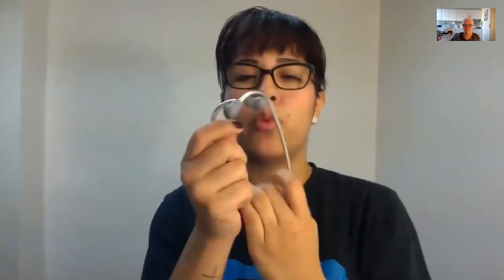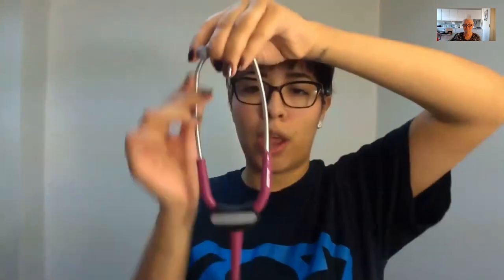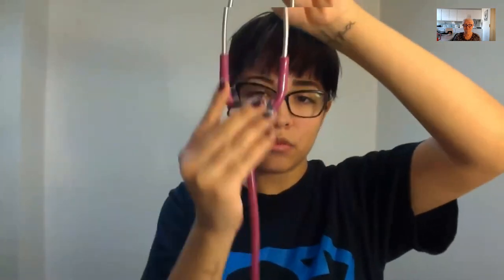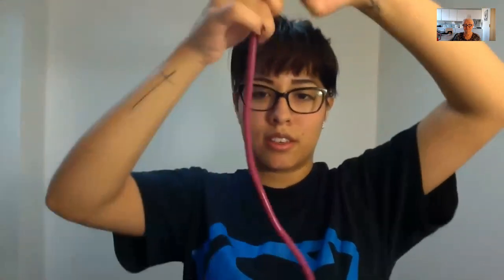I usually wipe these ear pieces down with alcohol wipes. And if you work in healthcare, you would probably have an abundance of Clorox wipes that you can use to disinfect this easier. And I use Clorox wipes at work to wipe this down. I always clean it all the way down with this.